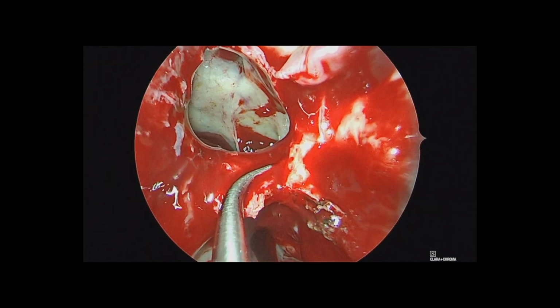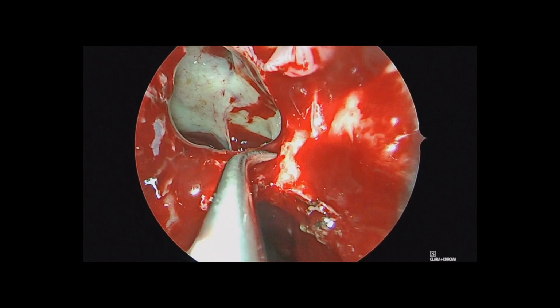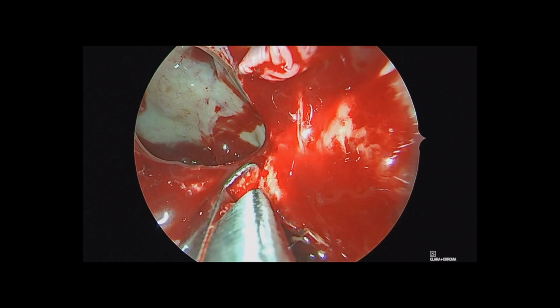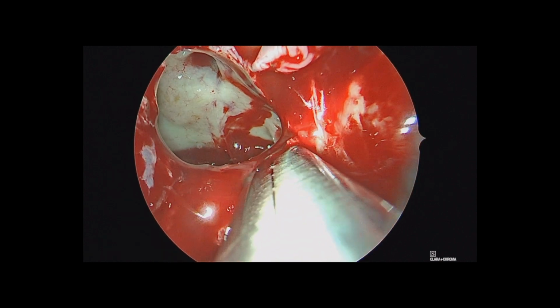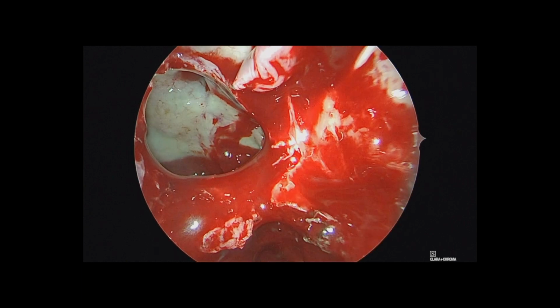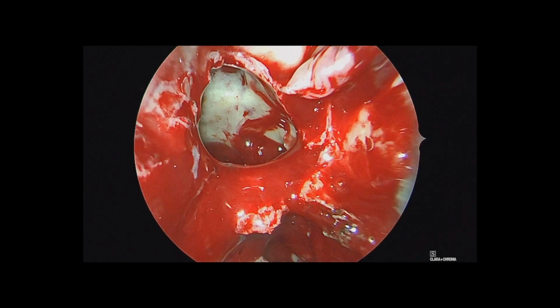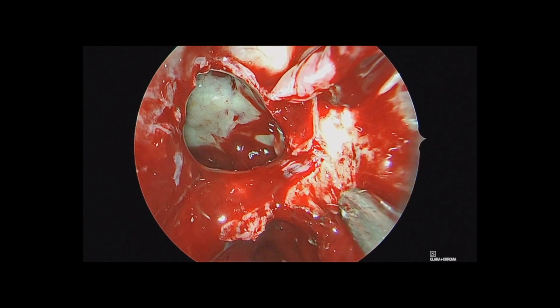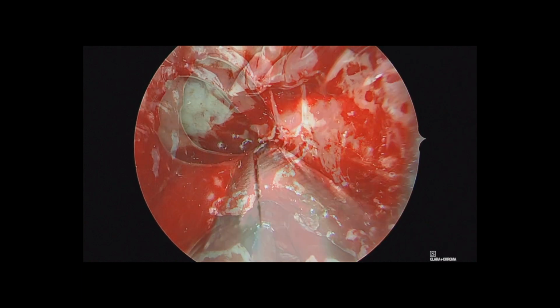And here we are identifying the sphenopalatine foramen from the pterygopalatine fossa into the nasal cavity as we perform our transpterygoid approach. Utilizing a Kerrison rongeur, we'll open up into the sphenopalatine foramen, ensuring we keep the periosteum of the pterygopalatine fossa intact, as we dissect out just over top of the sphenopalatine artery, as you're beginning to see visualized there.